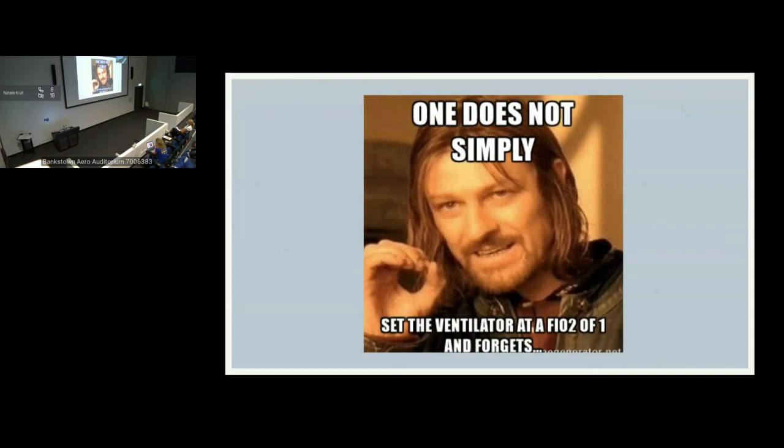Expect that with these settings, in a lung that has already reduced gas volume and is highly edematous, you're going to lose all tidal volume and you're only going to be ventilating dead space. That's okay. The whole point of establishing ECMO is to rest the lungs, and they'll usually become ECMO dependent at this point. Their PO2 actually drops as they go on, and that's okay as well.